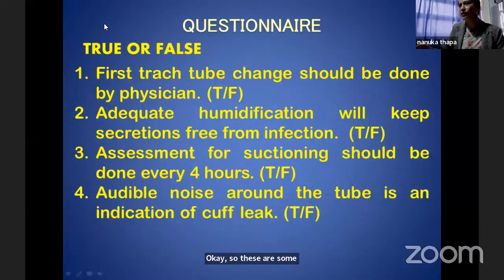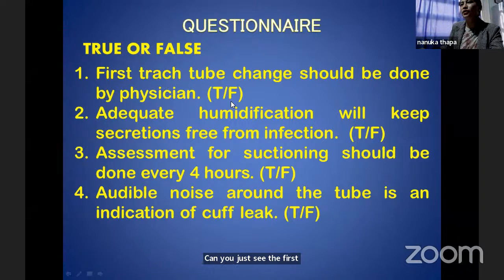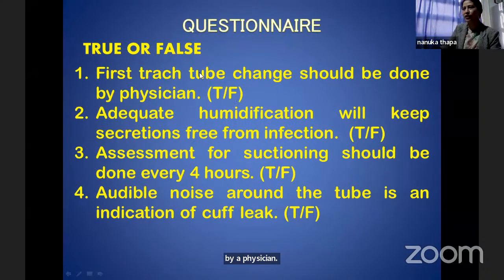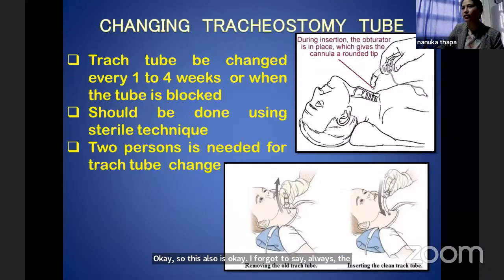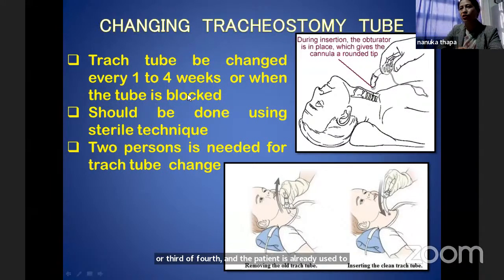Can you just see? The first trach tube should be changed by a physician. I forgot to say this earlier: the first tracheostomy tube should always be changed by a physician. It should not be changed by you. But if it is a second or third or fourth change, and the patient is already used to changing of the tracheostomy tube, then you can change it. But the first should always be changed by the physician, as there can be complications, okay?